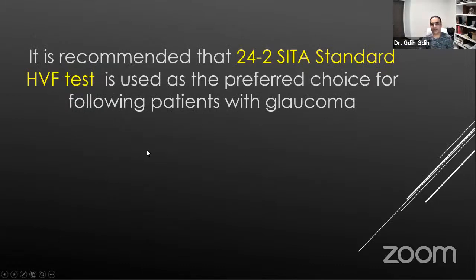If you want to take a screenshot of this one, go ahead, because what's written in yellow is what I want you to go to your machine and select for your glaucoma patients going forward. It is the most recommended strategy and test type that you need to use for glaucoma, in diagnosis and also for follow-up.